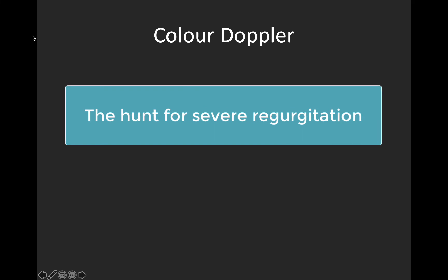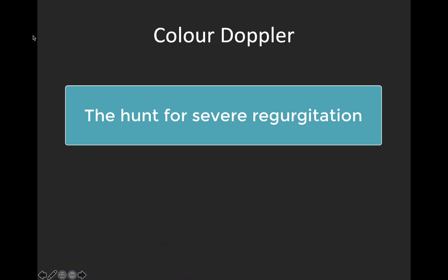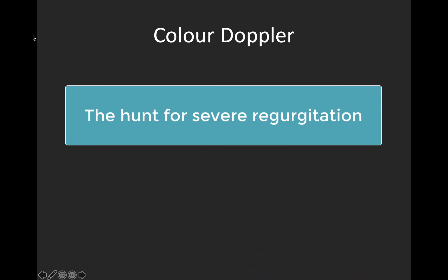In terms of what pathologies we're looking for with color Doppler at a basic POCUS level, we're going to be looking at valvular regurgitation and specifically severe regurgitation. Severe acute regurgitation can be life-threatening, so this is an important thing to rule out in the patient with hypotension or a suspicious clinical context. Although severe stenosis can also have devastating hemodynamic consequences, we need more advanced techniques — spectral Doppler — to identify and quantify it. Severe regurgitation, on the other hand, can be appreciated qualitatively using color Doppler at a basic POCUS level, so we're focused on identifying severe pathology.